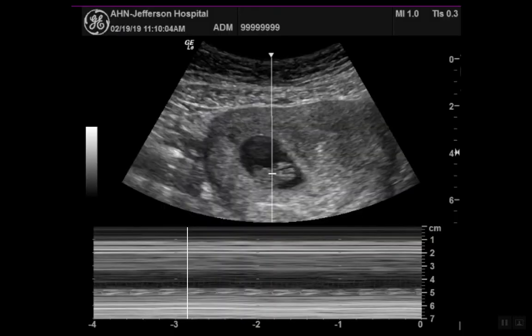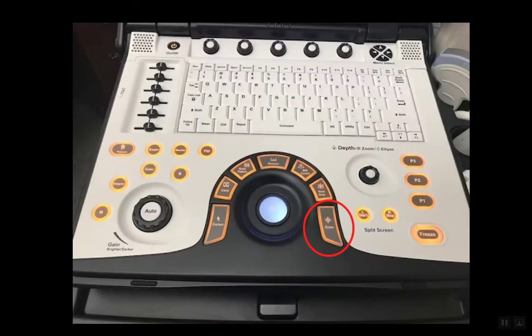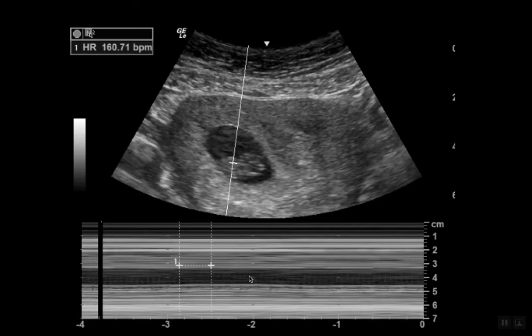Once you do that, you're going to get a line as seen here. Press the enter key, and then move a second tracing to get to either the peak or the trough to capture one heartbeat. As shown here, you'll see a result — in this case, 160 beats per minute.